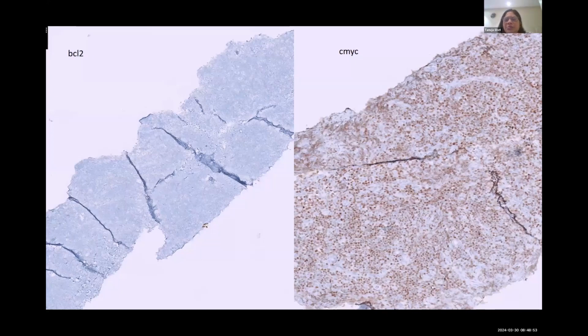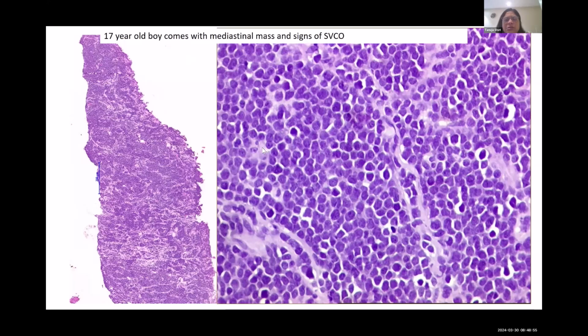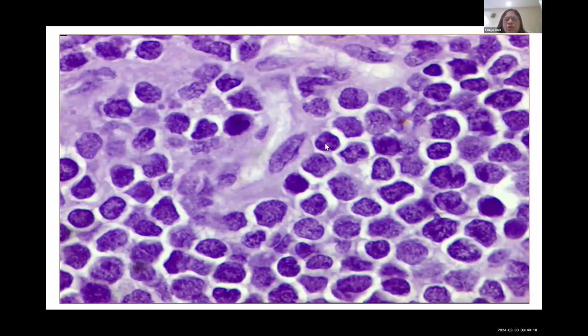This, on the other hand, is a mediastinal mass. Again, an intermediate size tumor. You can see that's the macrophage nucleus, almost similar to that. But as opposed to Burkitt's lymphoma, no nucleoli, very finely stippled chromatin and very, very fine cells. That's why sometimes in a mediastinal mass, due to crushing, we don't ever see proper morphology because this tumor is fragile.